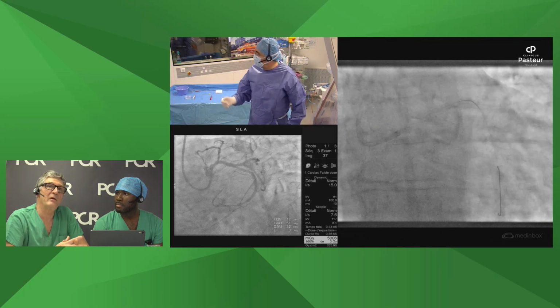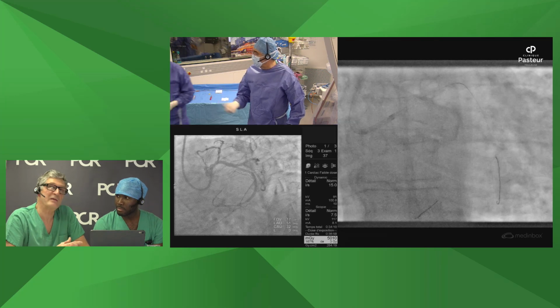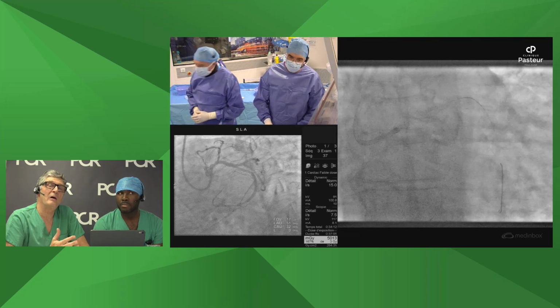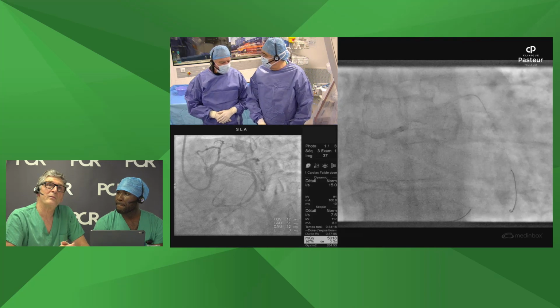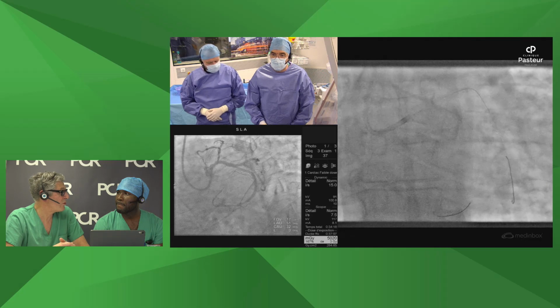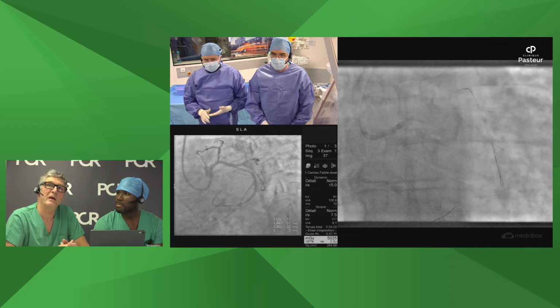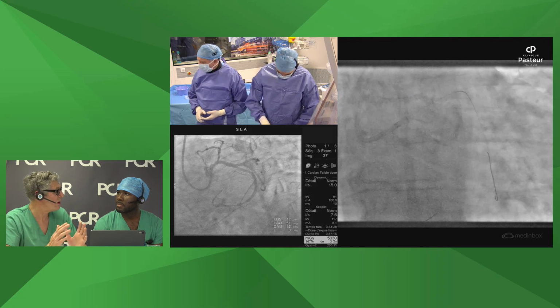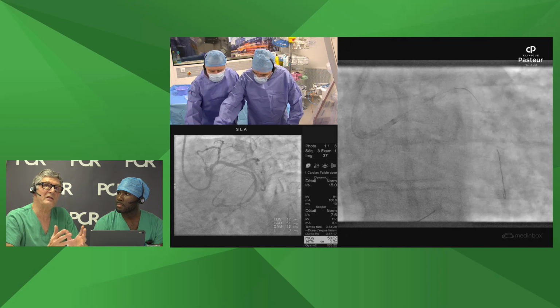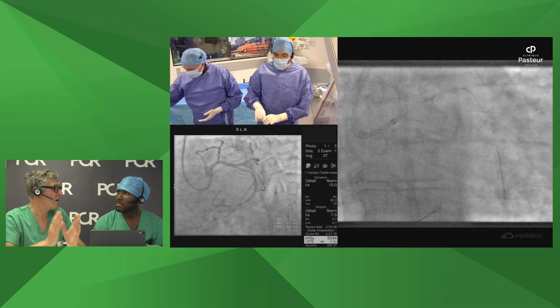It was shown by the group that outside of the left main, it looks very good. For the circumflex, we have tried to use this technique in my center, even also for the left main, and we had the feeling that we are not able to reposition the carina in the center, because what is important with a kiss is that you want to have a carina in the center.